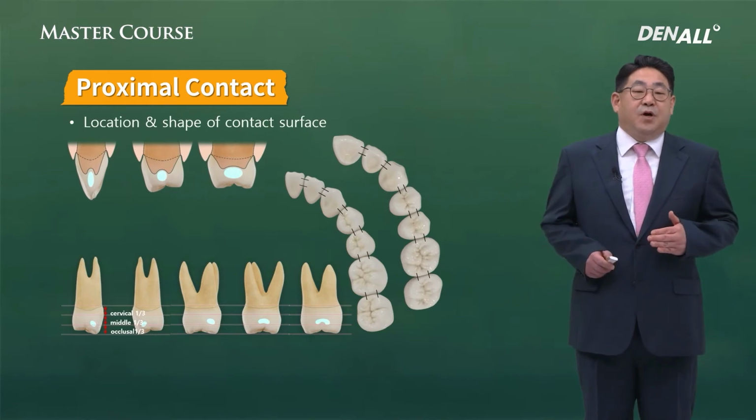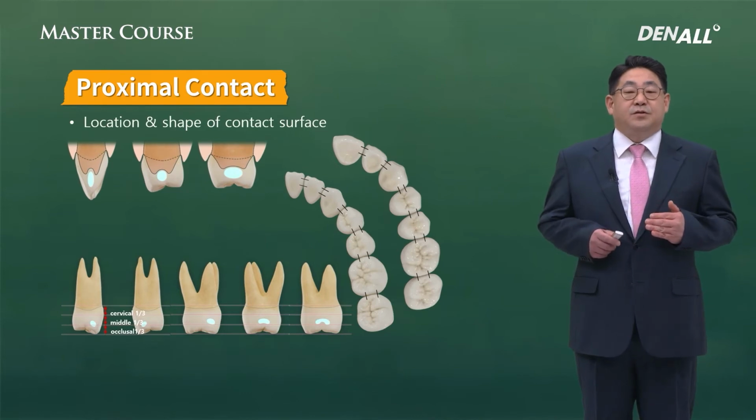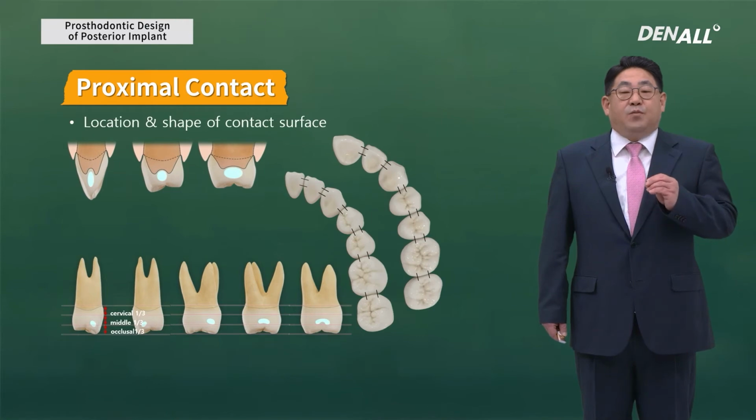Although we try to stick to these principles, clinically speaking, we see cases that really do not. Due to proximal wear, it gradually moves towards the occlusal table.